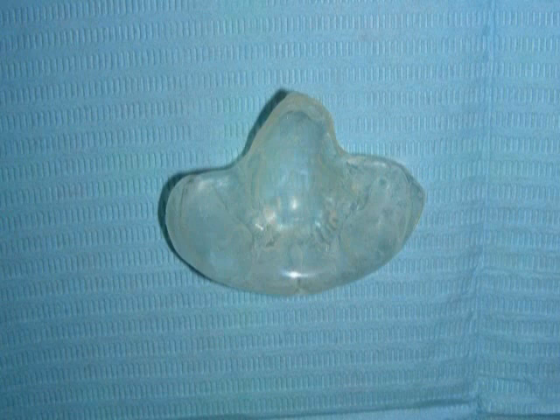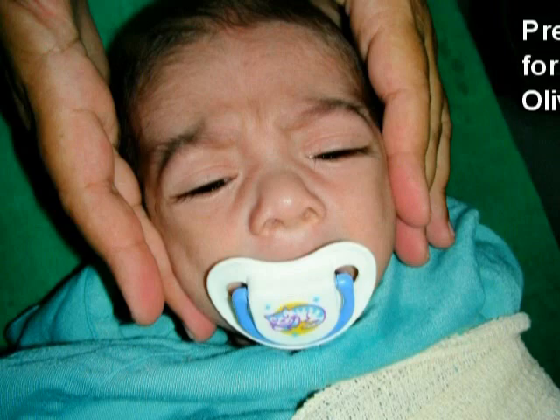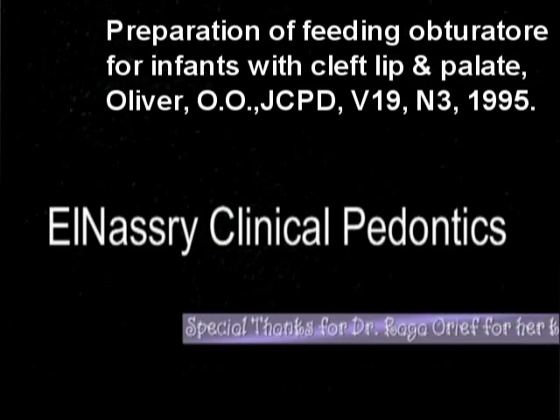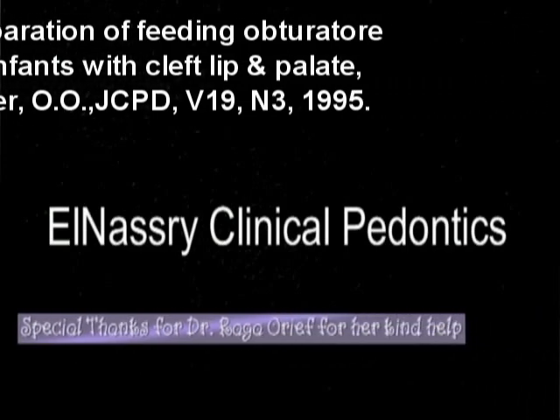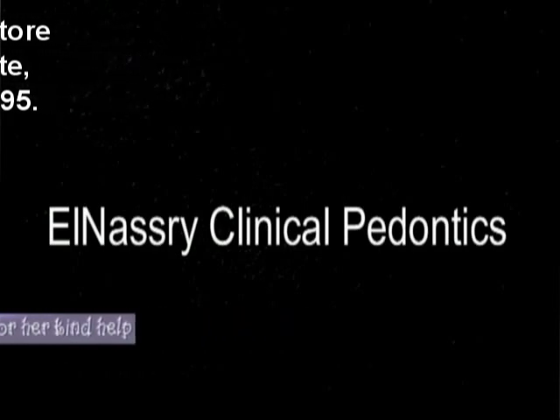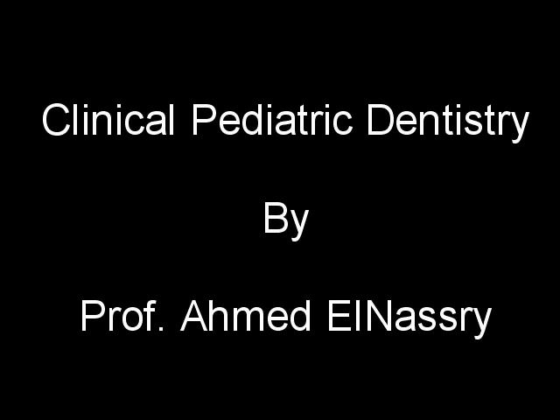So we have to cut this posterior extension and finish the obturator with the posterior seal of the hard palate.